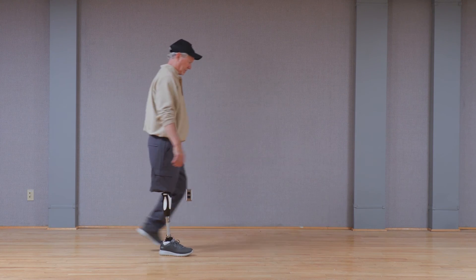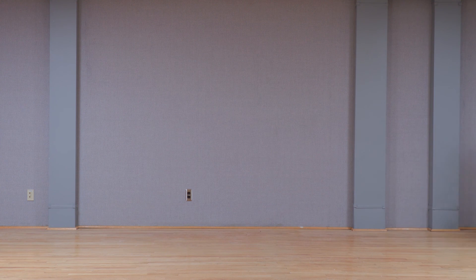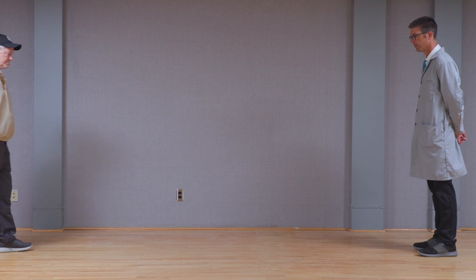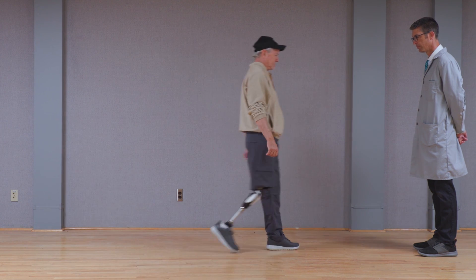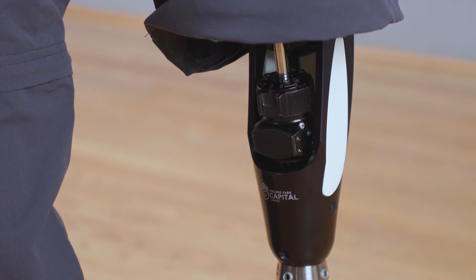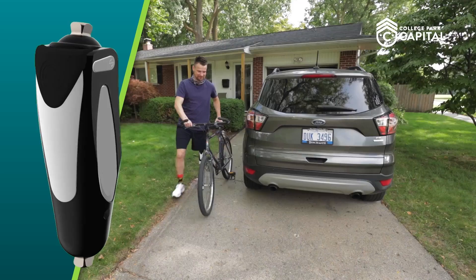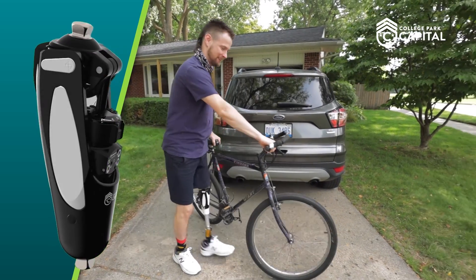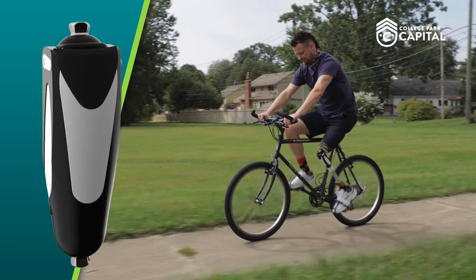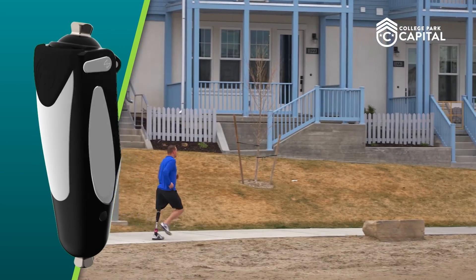Now that all settings have been optimized for the user, have them ambulate again with varying speeds and step lengths to ensure fine-tuning is not necessary. Once all settings are acceptable, it is recommended to place the adjustment cover back on the knee to prevent tampering with any of the adjustment screws. We hope that this video has helped you have a better understanding of how best to adjust the Capital Hydraulic Knee to optimize function for your users. The Capital Hydraulic Knee from College Park — smooth, stable, dynamic function to meet and exceed the needs of even the most active prosthetic users.